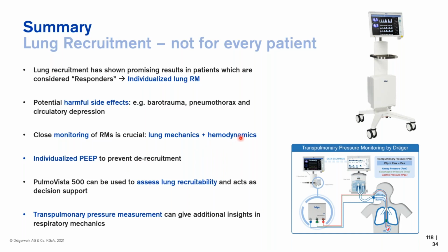So after lung recruitment, very important, of course, setting individualized PEEP to then prevent de-recruitment. Definitely. And I think now we've learned that actually Pulmovista can be used to assess recruitability, both in the OR and in the ICU. It should be used as a decision support tool.